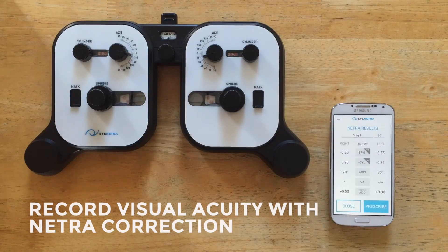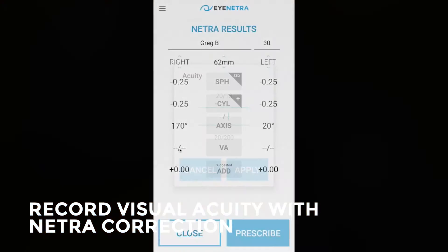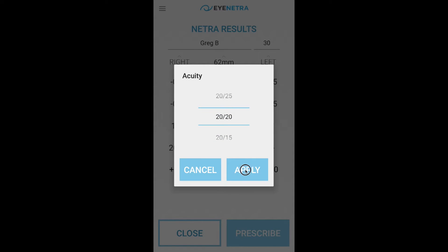Okay, so now let's go ahead and record our visual acuities with this initial Netra correction. On the right side I was reading line 20-25 and on the left I was reading 20-20.